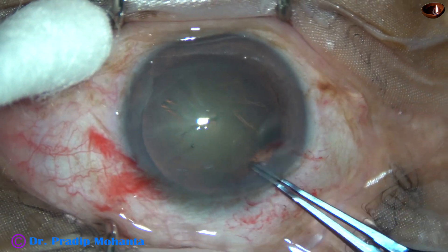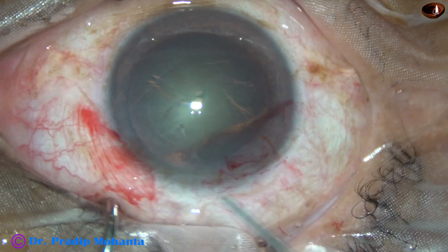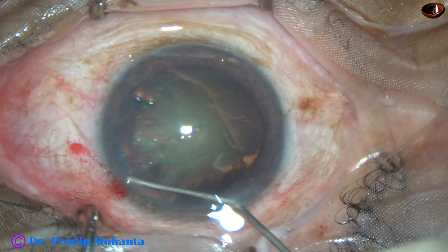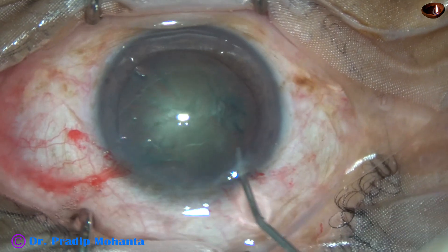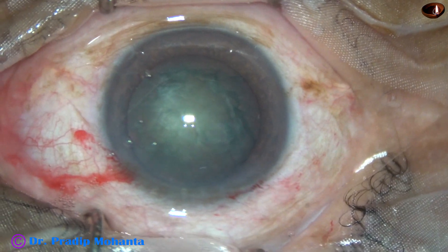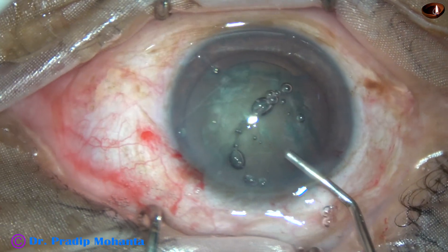Capsulorexis is done with the help of a utrata forceps. Hydrodissection is being done with the help of a 27 gauge cannula and BSS. The nucleus is nicely mobilized. Now 2% HPMC is injected into the anterior chamber, and the AC is filled up with this viscoelastic.